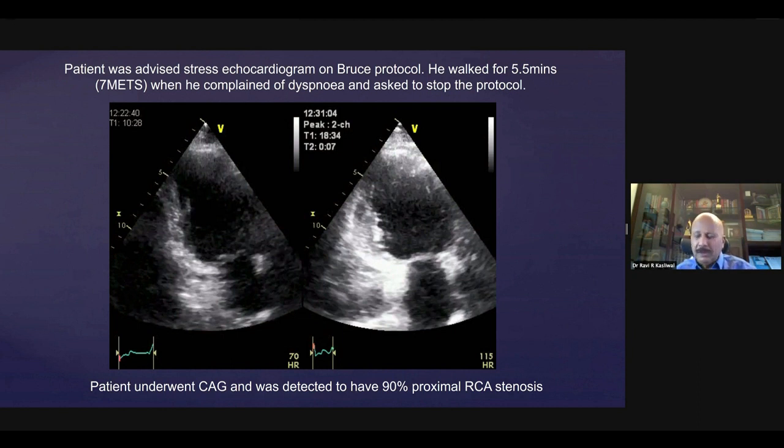Mind you, I'm not speaking on just stress echocardiography, but I will say that stress echo is reported as abnormal in the presence of wall thickening abnormality, but you should have at least 2 contiguous segments. And before you actually start a test, you must look at their pre-test probability. Here, of course, the patient was obese, had hypertension and diabetes and came with chest discomfort, so the pretest probability of this patient of having coronary artery disease was very high. But if you have chest pain, changes in more than two contiguous segments, you're pretty sure you're dealing with an abnormal. And this patient then underwent a coronary angiography and was found to have 90% proximal stenosis.